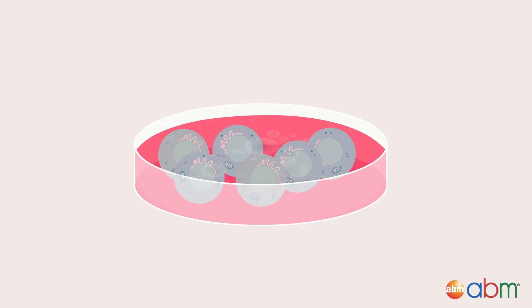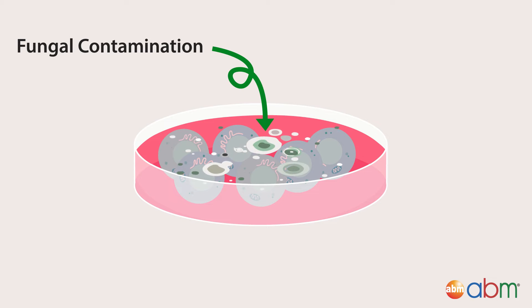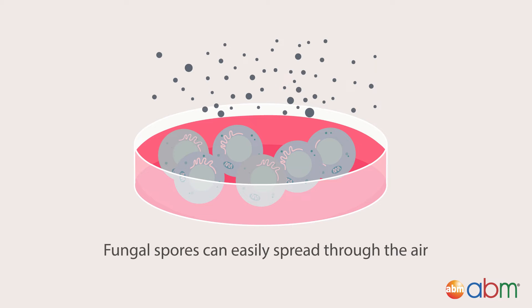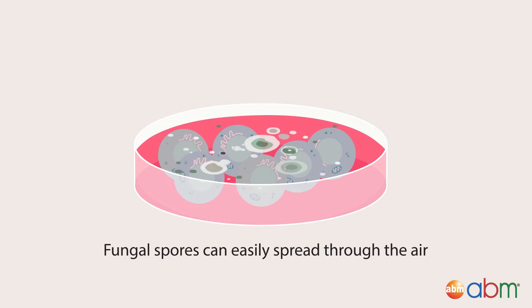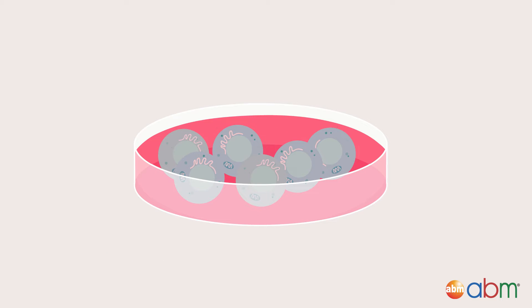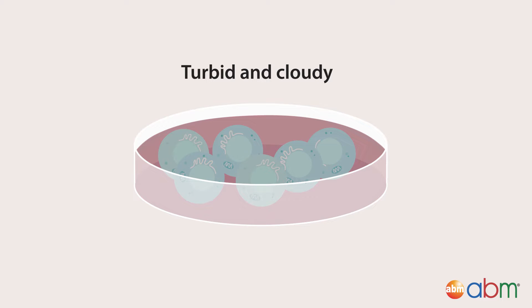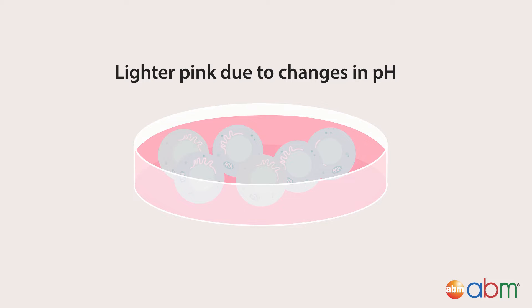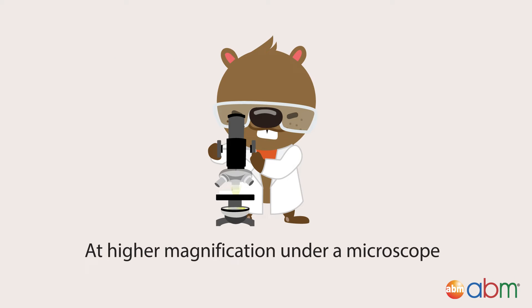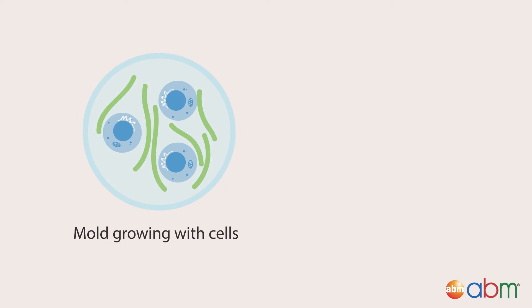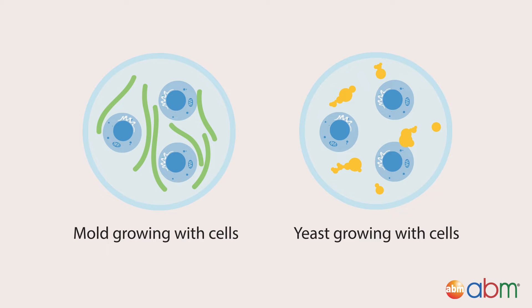If you see small gray, white, or greenish colonies floating at the surface of your medium, you've got fungal contamination. Fungi can spread easily through the air in their spore form until they find suitable growth conditions. If fungal contamination is full-blown, your medium will become turbid and cloudy and may start to change color, becoming a lighter pink due to changes in pH. At higher magnifications under a microscope, you'll also notice long fiber-like structures growing among your cells if it is mold, or clusters and chains of small round branching ovoid particles if it is yeast.